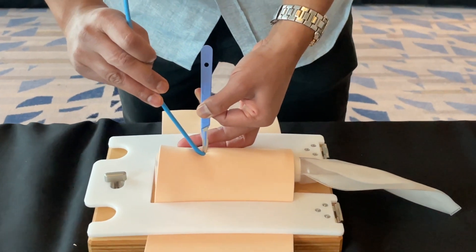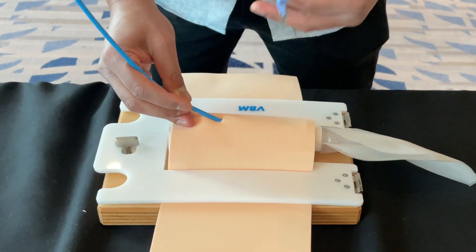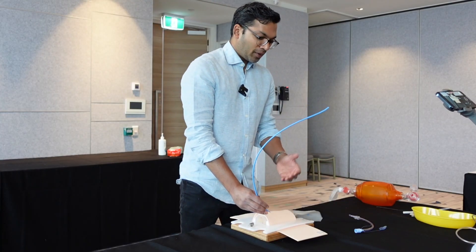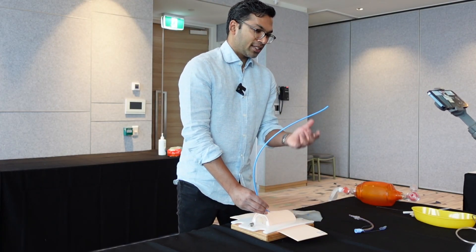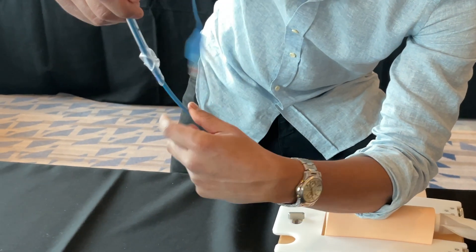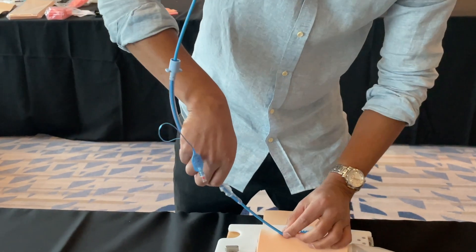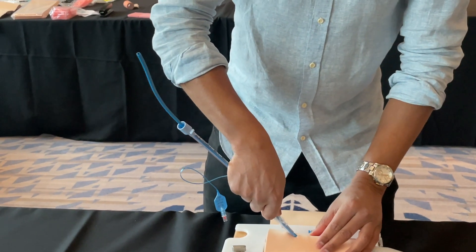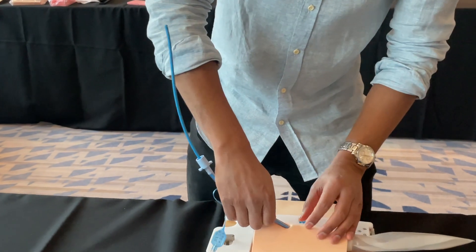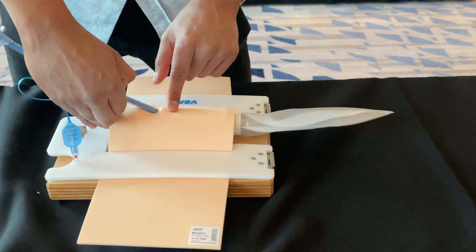Once I'm in the trachea, I turn the bougie caudally down towards the lungs and push it through. I'm mindful not to push it too far to avoid causing trauma in the airway. I remove the scalpel safely — this is typically a two-person technique so you can stabilize the bougie while also passing the size six tube. I then railroad the tube down, giving a small rotation and pushing it to the black line, just as in a normal intubation, so the cuff sits in the trachea.